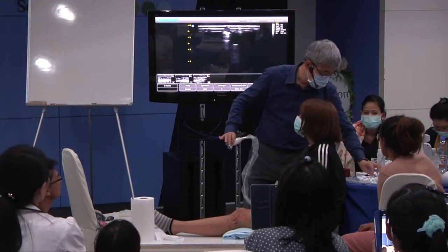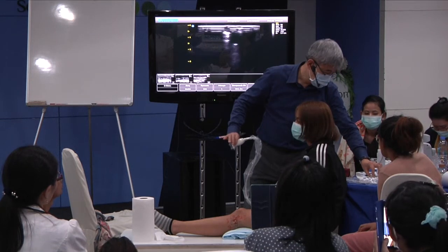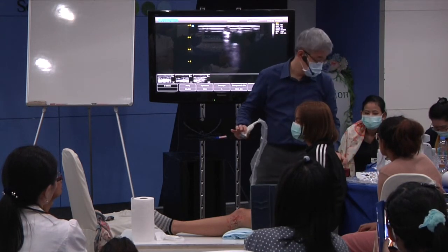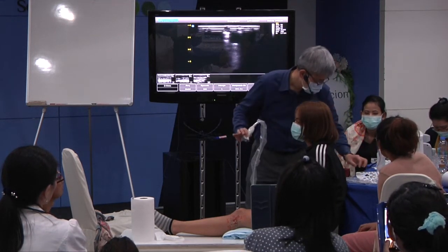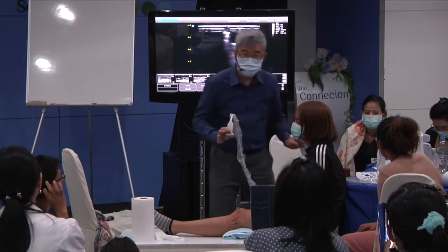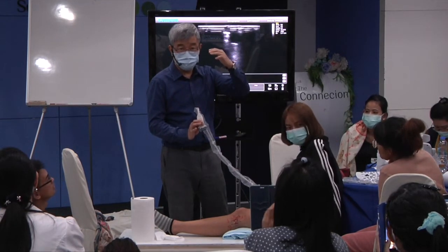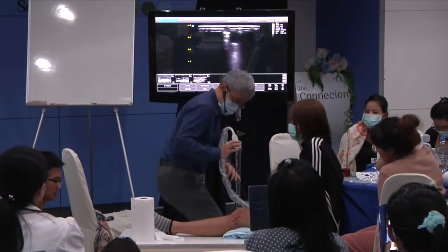As I said, this machine is very good about the range. Yeah, about the range between 1 and 2 to 3.5.